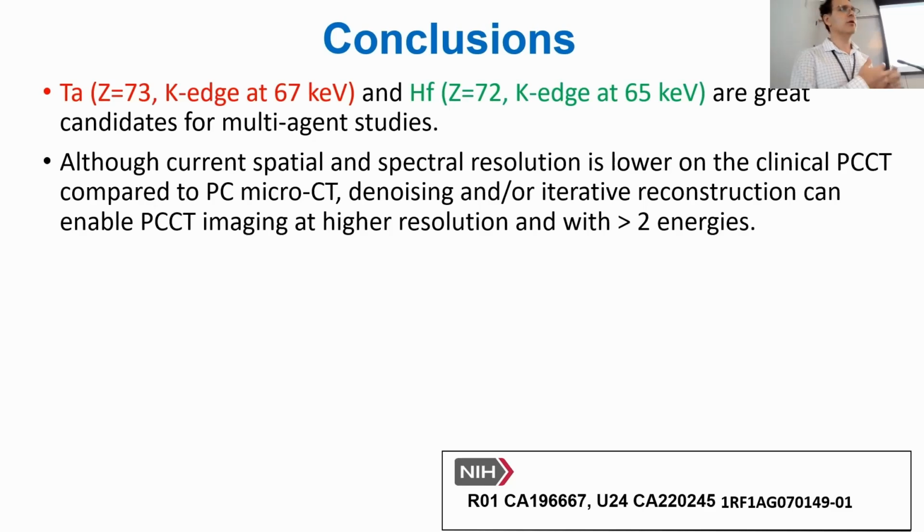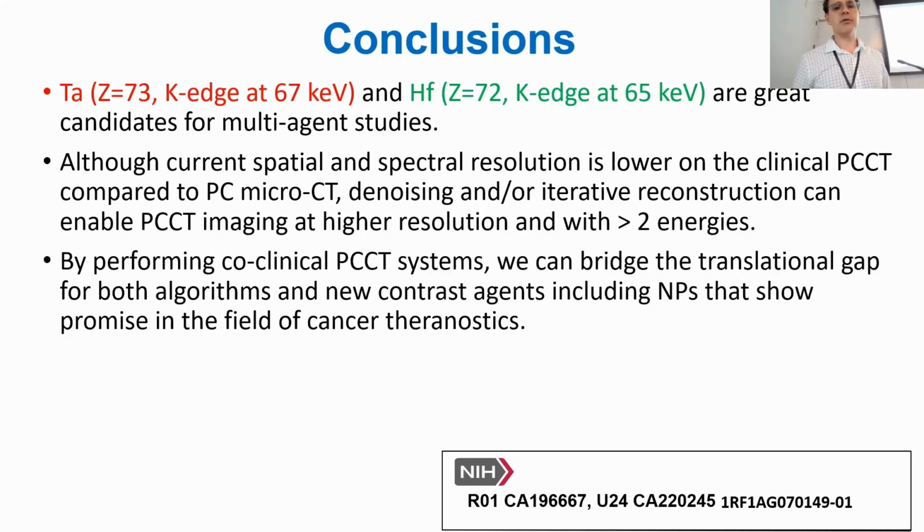And I think the other message is that there is potential to have on the clinical side higher resolution, both on the spatial and spectral side. And I believe that the experiments that we did preclinically show a proof that we can gain something by trying to use those higher resolutions, both spatial and spectral, on the clinical scanner.